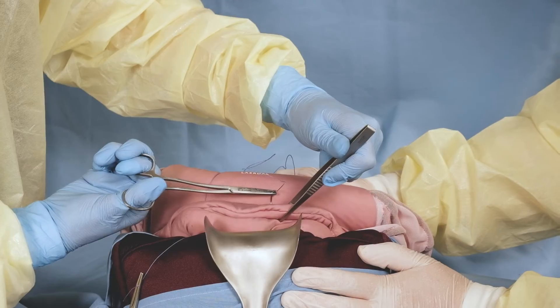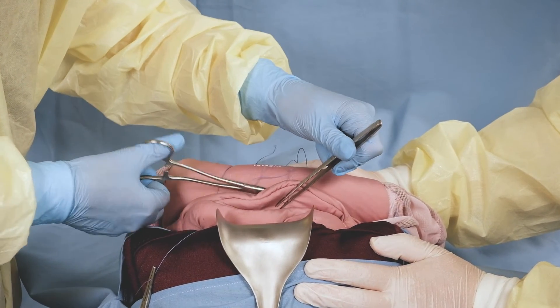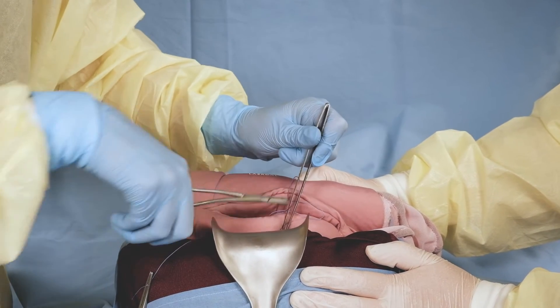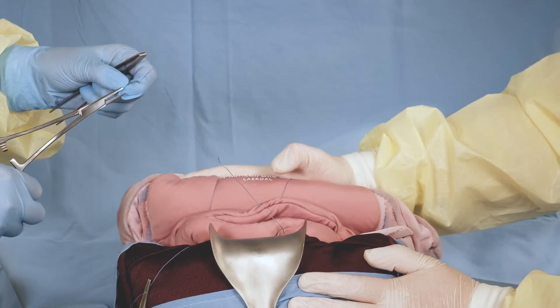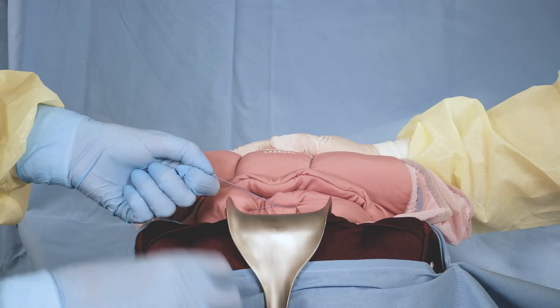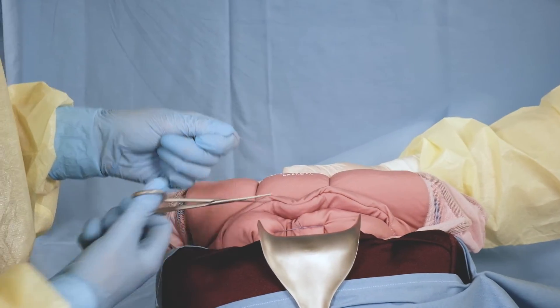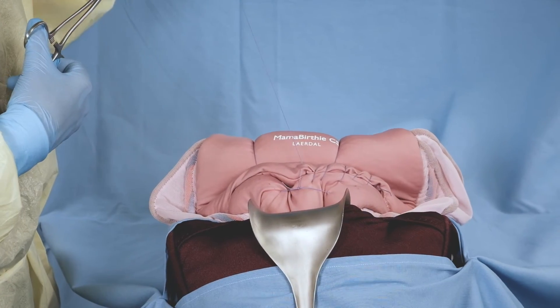Take the suture back over the fundus to the front. Insert the needle 3 cm above the incision and exit 3 cm below the incision. Tighten the suture while the assistant compresses the uterus and tie a knot in the front. Cut the ends of the suture. Close the uterine incision.